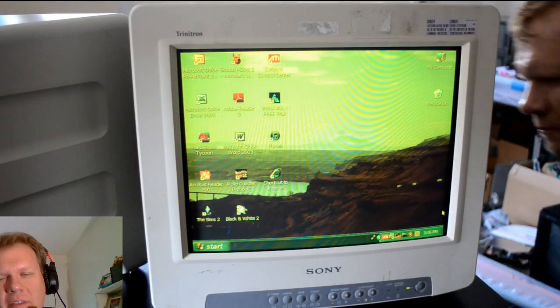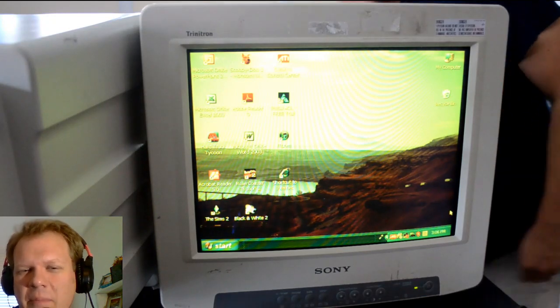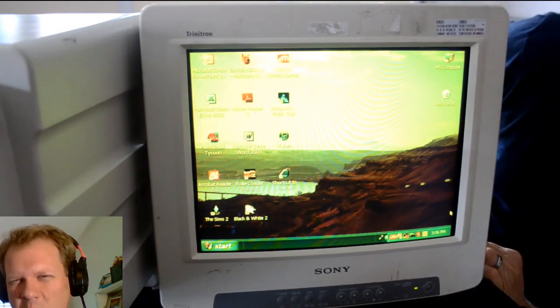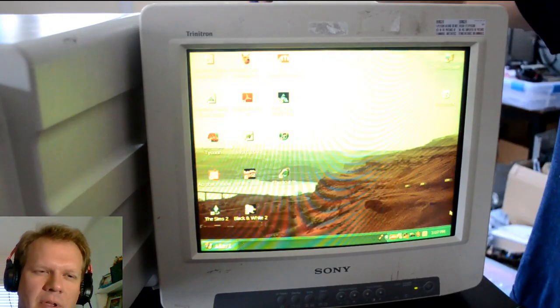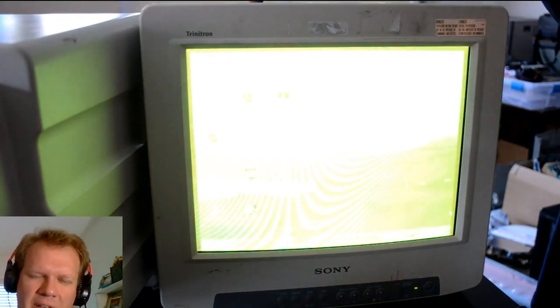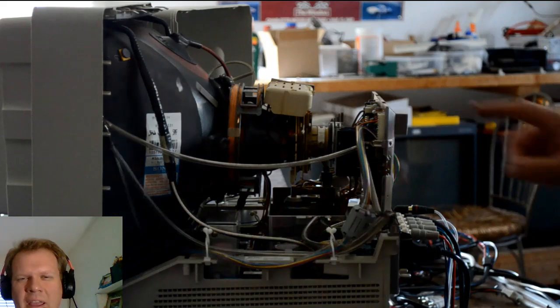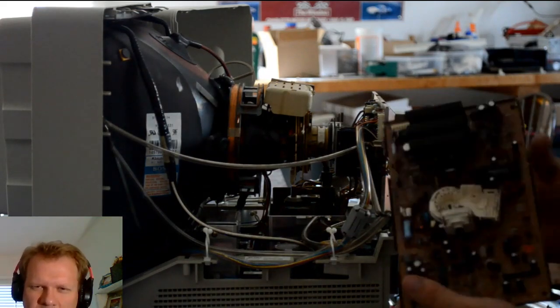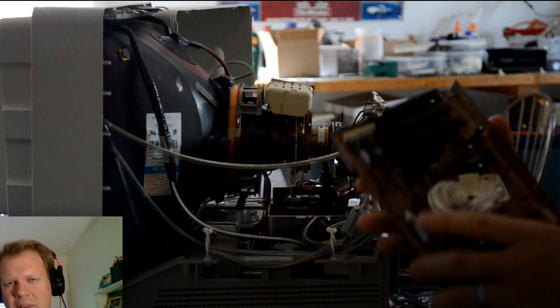Now that I had the monitor open, I wanted to test a little bit, turn up the screen brightness and mess with it. There are a couple of potentiometers in there that let me make some adjustments as far as screen brightness. That's what I did first, but I was still missing a color. And that was telling me that probably something was bad on the original CRT neckboard. And that had a lot of components on it.